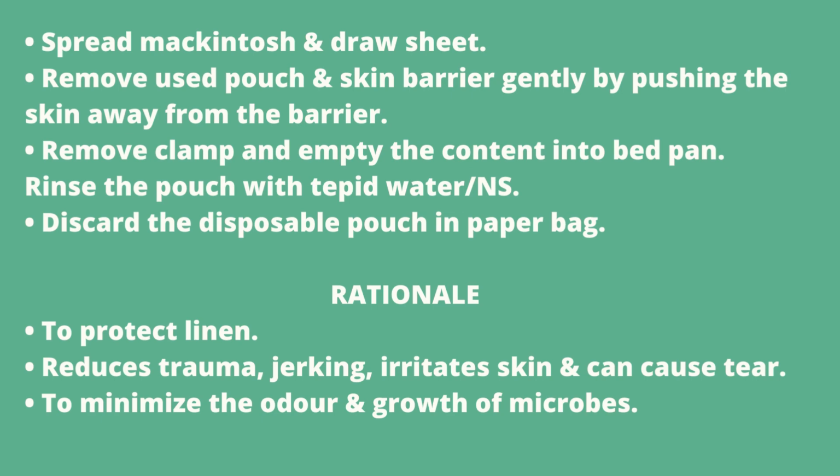So we need to use pouch. Remove this pouch and skin barrier also. Okay, remove clamp. जो हम लोगों ने क्लैंप यूज किए हैं, उसमें वो जो क्लैंप है वो भी हमको रिमूव करना है, and empty the contents into the bed pan. जो बैग है उसका जो भी वेस्ट मटेरियल, जो फीकल मैटर है, उसको एम्प्टी करना है, किसमें, बेड पैन में.